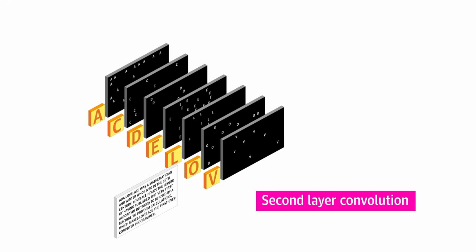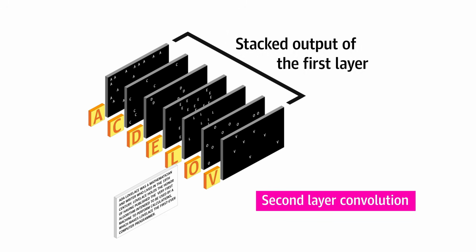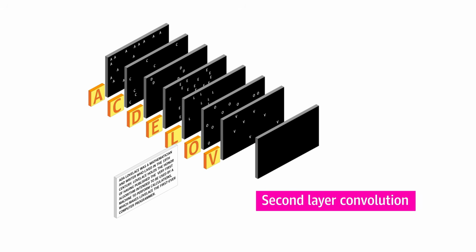In this layer, the CNN would spatially align and stack all those maps from the previous layer. This would allow the CNN to then look for short, specific sequences of letters in all the feature maps simultaneously. So the CNN would use a new set of filters to look for specific letters that are adjacent to one another in particular sequences.